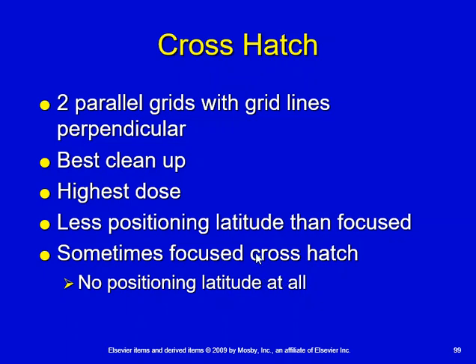With, again, a focused grid, you could off-center on the grid along the longitudinal lines of the grid, but with a focused crosshatch, you would have to be centered directly on the middle of that grid in order to not have grid cutoff.